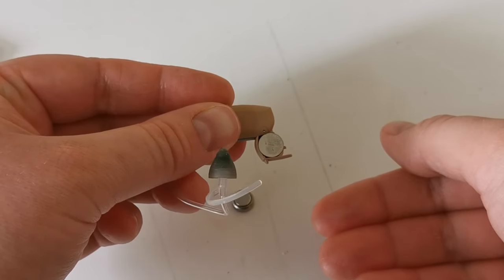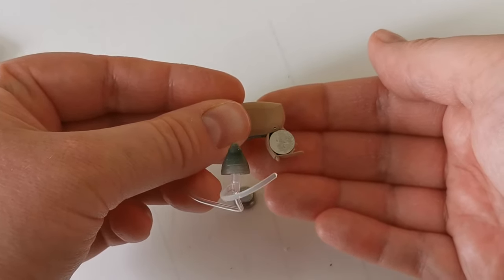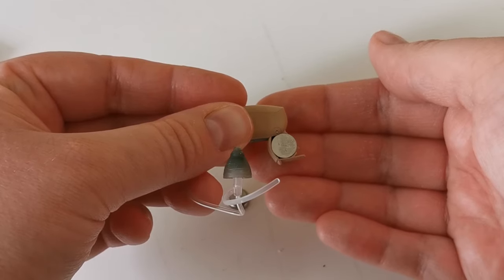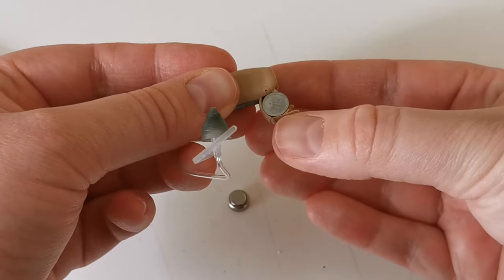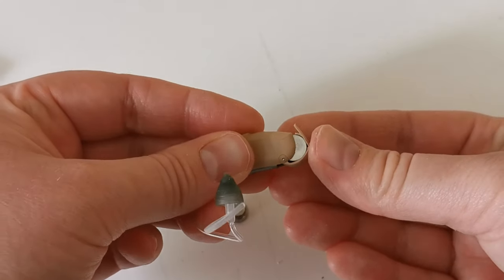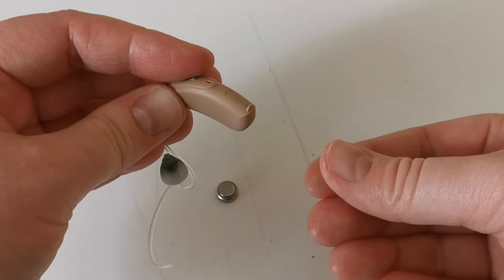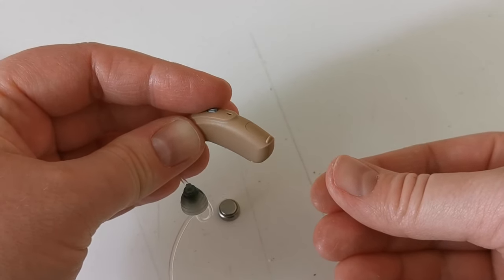Allow the battery to sit in the battery drawer for a minute before you close the door. Close the battery drawer to turn the hearing aid on, and that's how you change your battery.